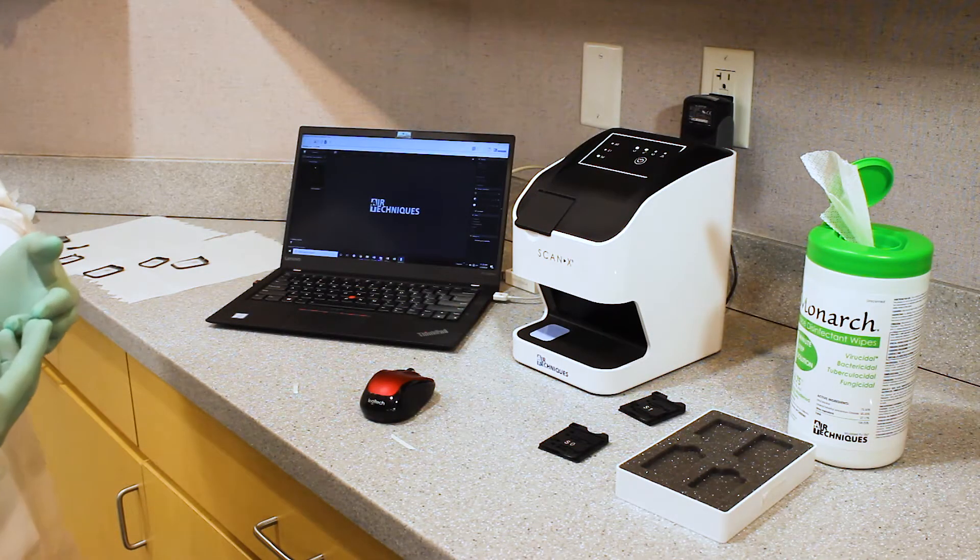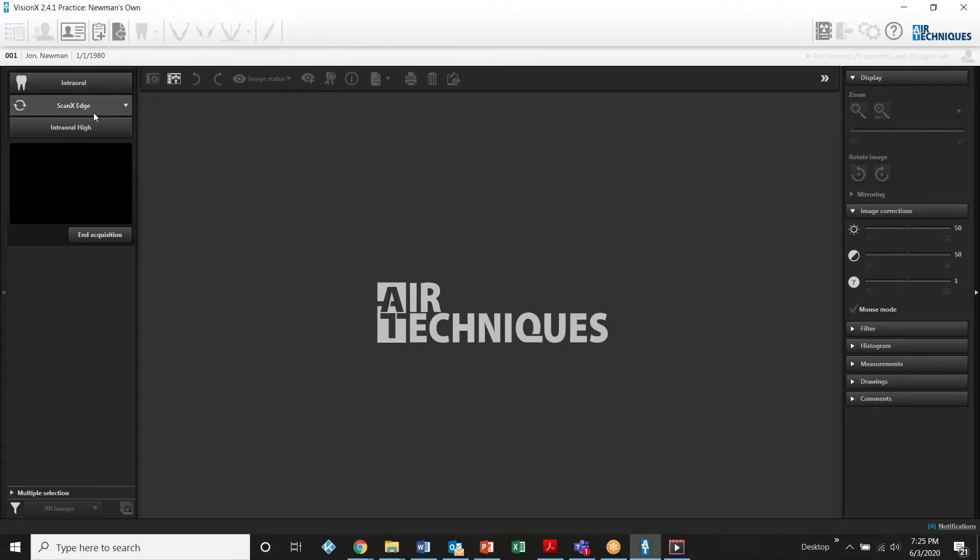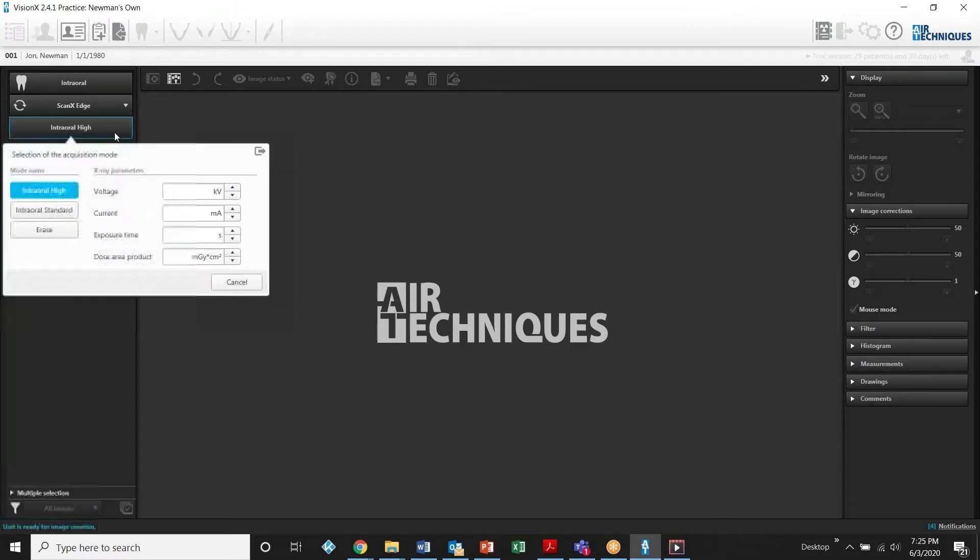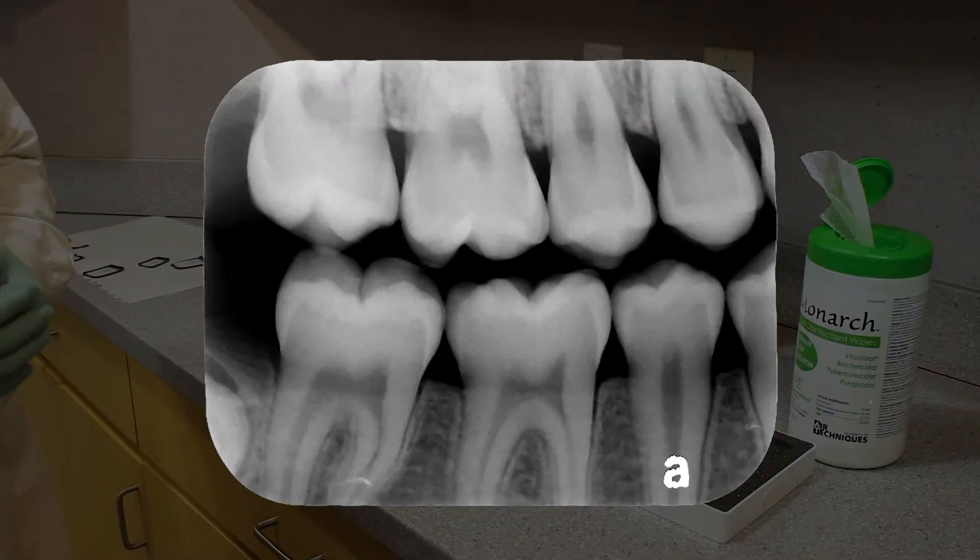This machine has two available scan modes for us to scan at. I happen to choose Interall High, which is the highest resolution available on this machine, but there is also a quicker acquisition mode called Interall Standard. We suggest using Interall High because it does produce the best image quality possible out of the machine.